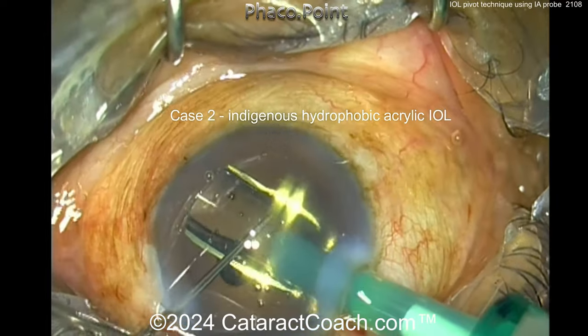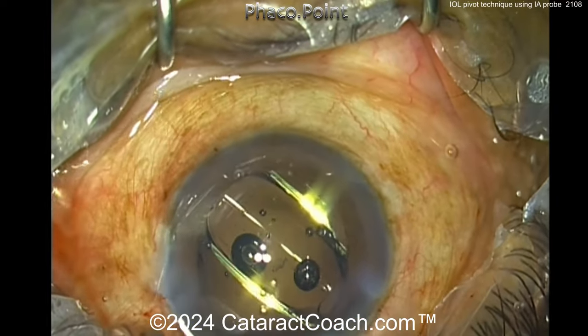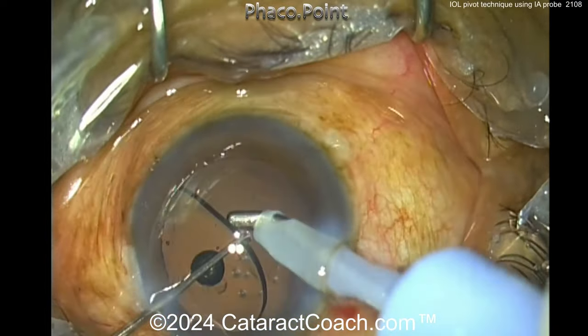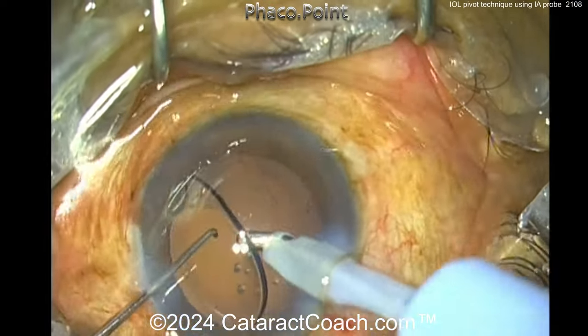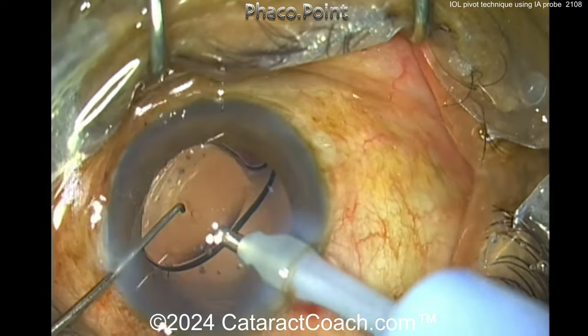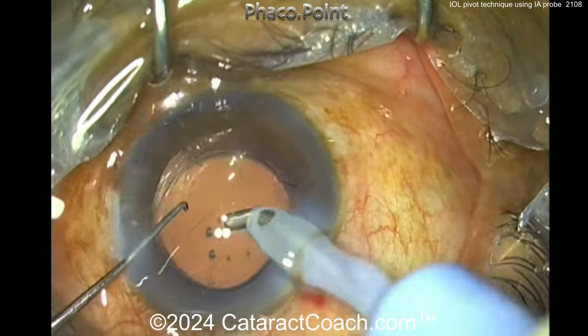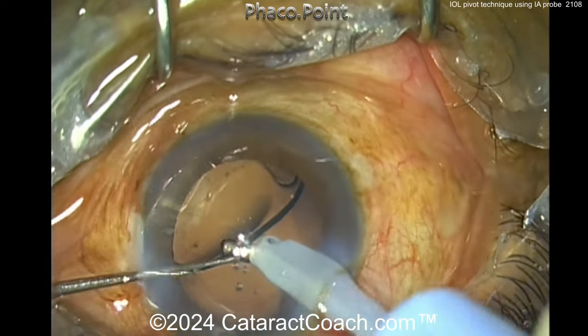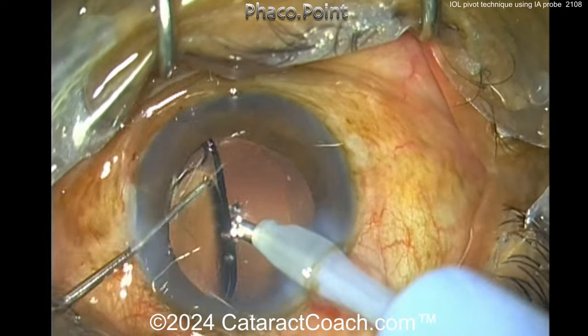Looks like a hydrophobic acrylic lens, perhaps of Indian origin, going into the capsular bag. Again, lifting up the optic, with the IA probe going underneath and using that probe to pivot the IOL in different directions. The technique certainly works well.